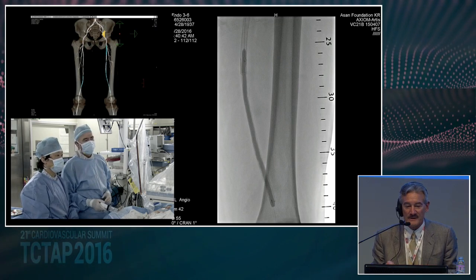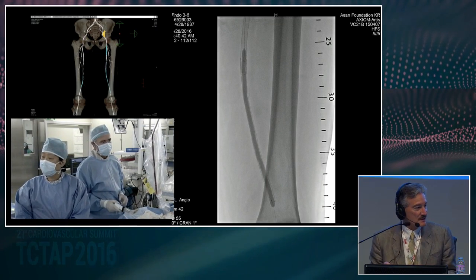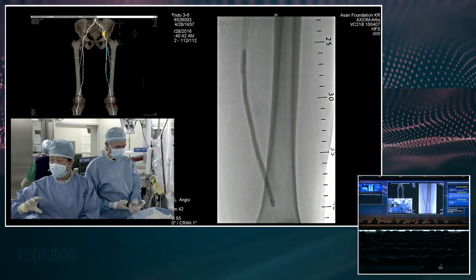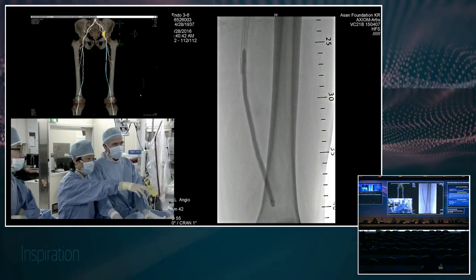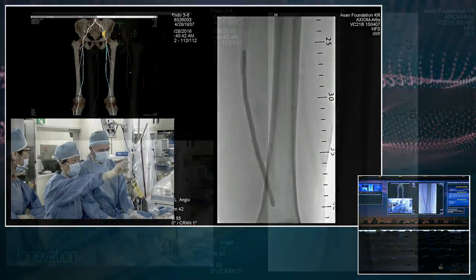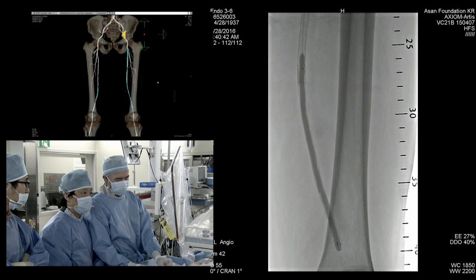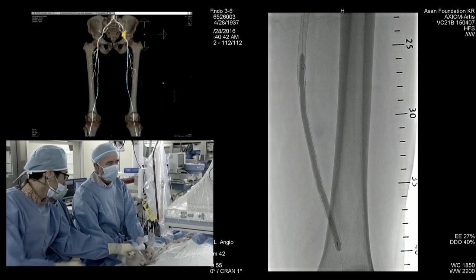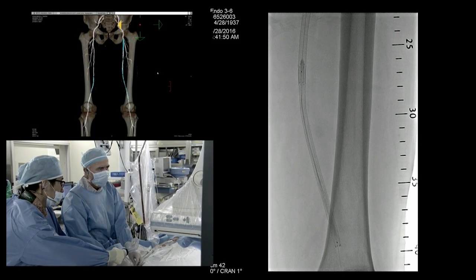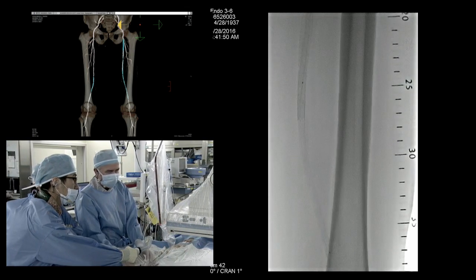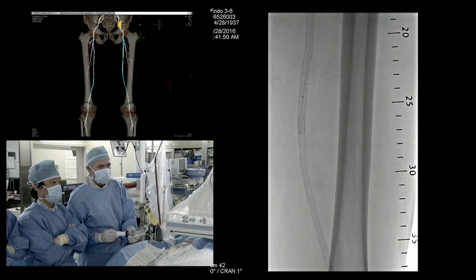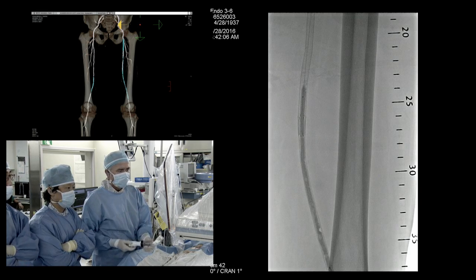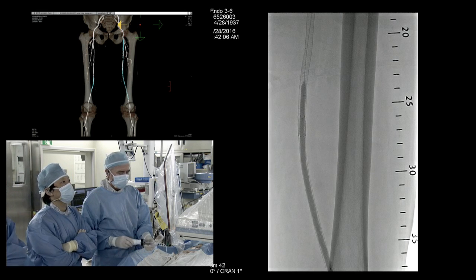That's why you hear enthusiasm for doing debulking with laser prior to DCB application in ISR. As a practical matter, laser is not commercially available for this indication, and most treatments for ISR worldwide are done as being done here. This is a 5-millimeter diameter, 5x150 balloon, which turns out was just a little bit short. The 5mm is well matched to the distal stent, but a little small for the proximal, so we may end up using two DCBs — a 5 distally and a 6 more proximally.